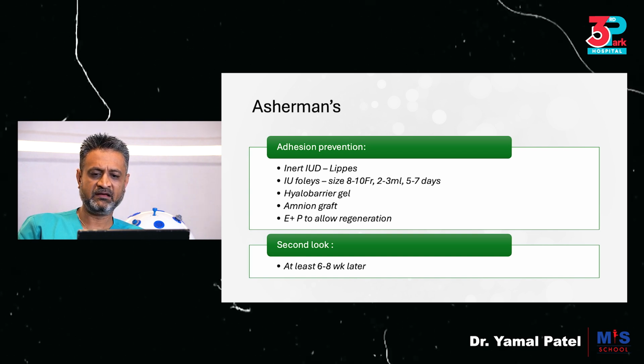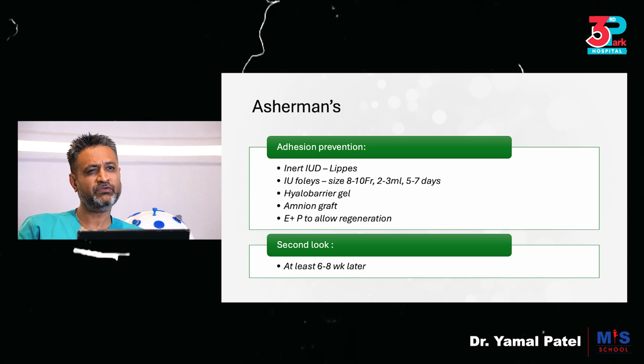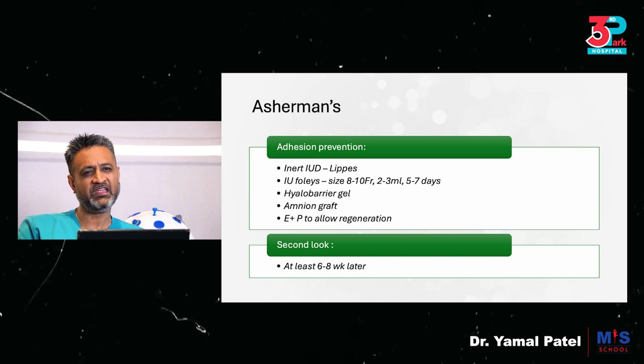And if you're considering a second look, then when should we do it? I think at least with a gap of 6 to 8 weeks following the initial procedure. So not earlier than 6 to 8 weeks of the procedure, you could actually go in and relook at the cavity. So that's the Asherman's covered, and I have had some extreme cases where I've had to do it in 3 sittings.